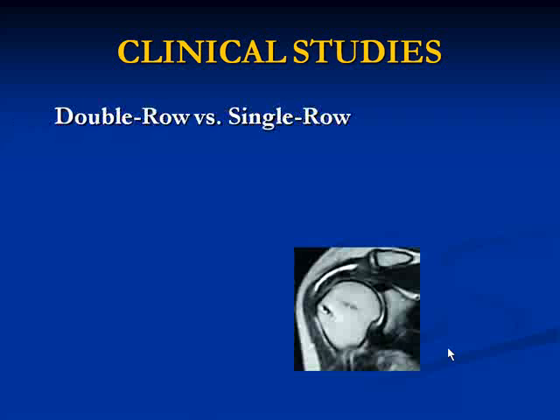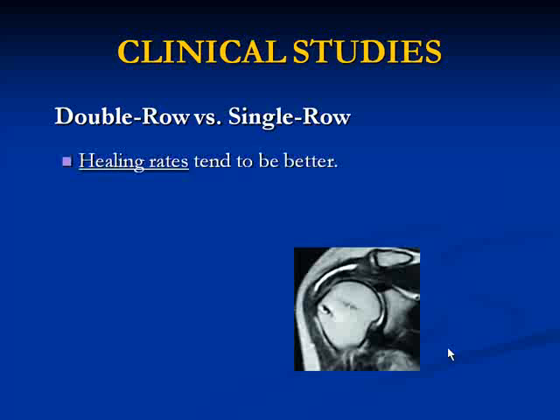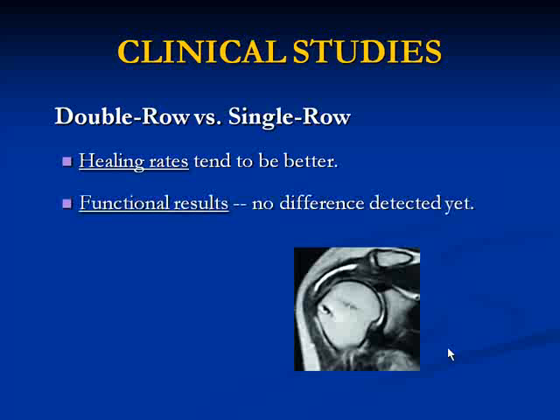So when we sum up all of these studies in the literature, to make sense of this is somewhat challenging, but I think we can say at this point that using objective measures, post-operative imaging, that the healing rates with double row tend to be somewhat better than single row. However, the functional results have not been shown to be different between the two groups. And whether with longer term follow-up, because many of these studies have relatively short follow-up, this may change, but of course this will require much more study in the future.